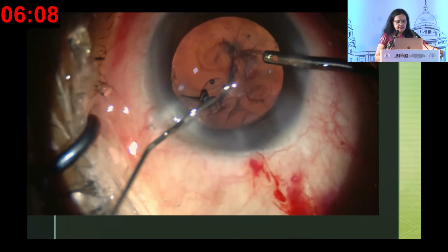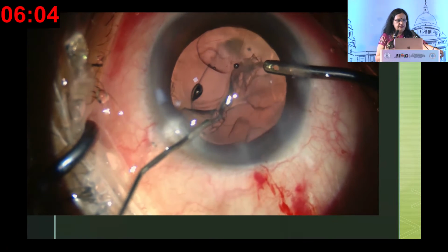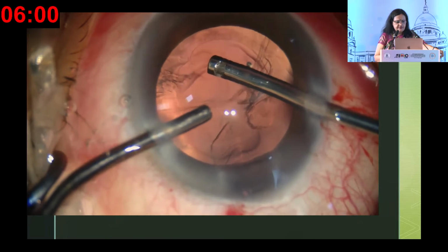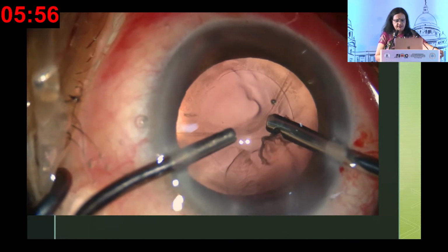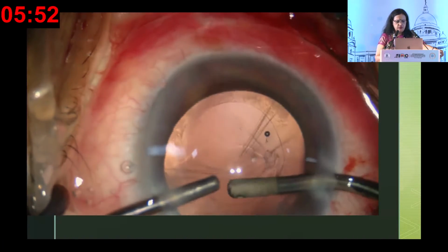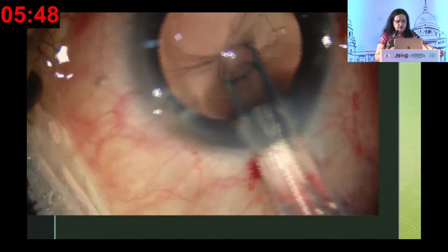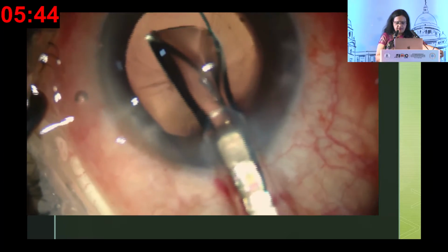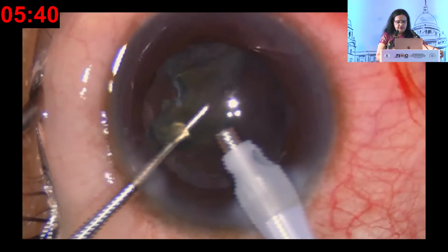So it has to be a bimanual vitrectomy, and to prevent further worsening of the opening, you inject some viscoelastic and do vitrectomy cutting. You can use the same vitrectomy cutter to aspirate also, once you've removed all the vitreous. Don't aspirate in the presence of vitreous. Once you're completely cleared, you can inject an IOL and do a pupil capture, optic capture, just like what Dr. Menu showed. So that is very important.